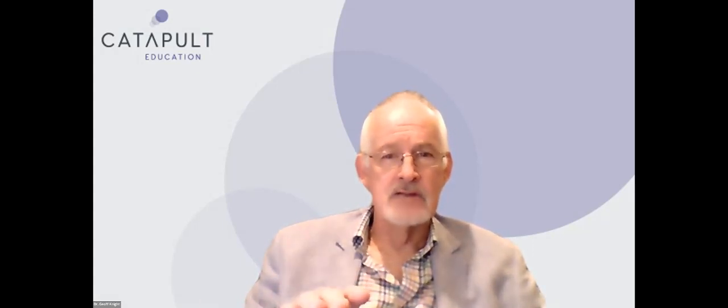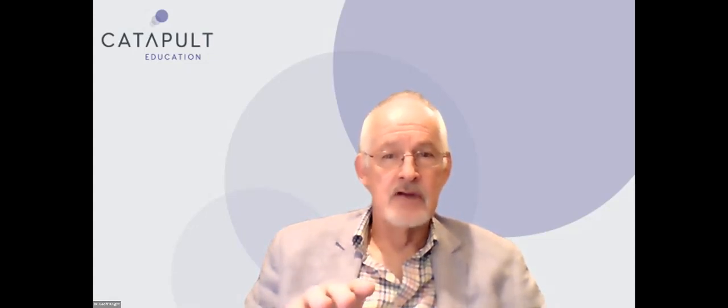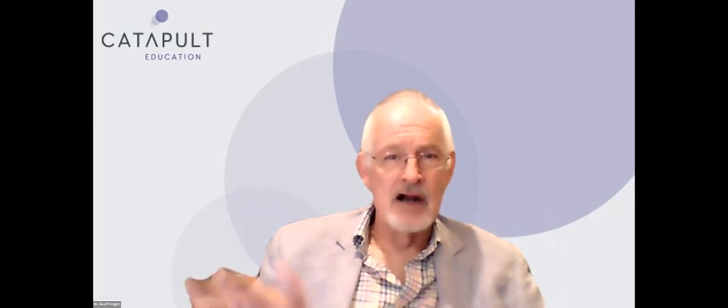The technique that I use is very quick, but the important thing is you've got to get that seal, because with resin modified glass ionomer cement in cavities, there's 8% post-operative sensitivity. I had a patient who sued me once in the early days when I started doing this, and I had to drill down, that's a good word, isn't it, and find out what the cause was. So you put a little bit down, spread it over the cavity, photocure it, put your resin modified glass ionomer cement down, exposing the proximal surface because it won't break down. Then you put your composite resin over the top.